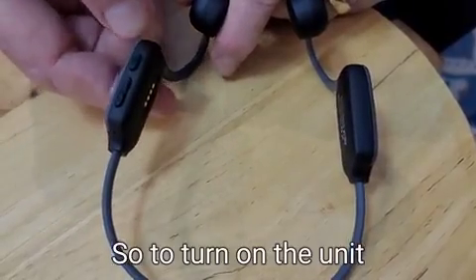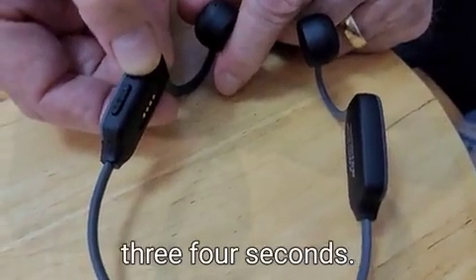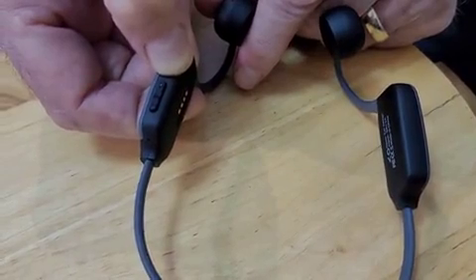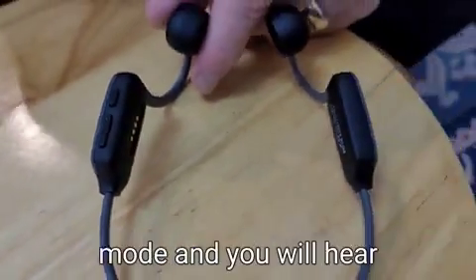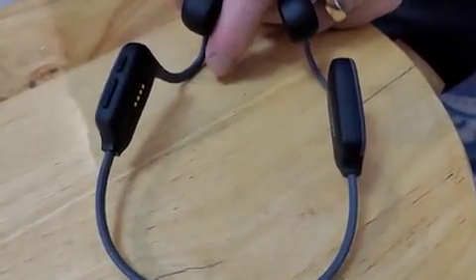To turn on the unit, hold the multi-function button for two, three, four seconds. The unit is on. Usually when it's on, it will be in Bluetooth mode and you will hear in the speaker: pairing.